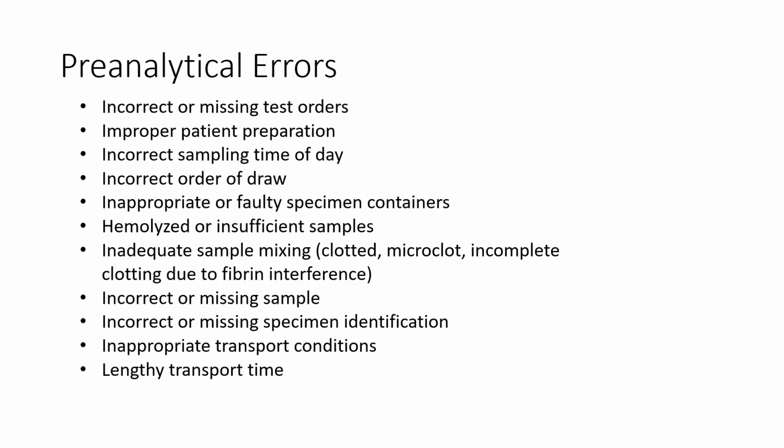Hemolyzed or insufficient samples. This again relies on the phlebotomist. Hemolysis is typically due to an incorrect needle size for the patient, and different types of techniques can lead to hemolysis. That typically lands on the responsibility of the phlebotomist. And insufficient samples means not getting enough blood into the tube. This is particularly difficult with neonates, trying to get enough blood. Sometimes they have different techniques, like scraping the back of the heel and getting blood out of there. But making sure that there is enough sample to be run on the analyzer is important.